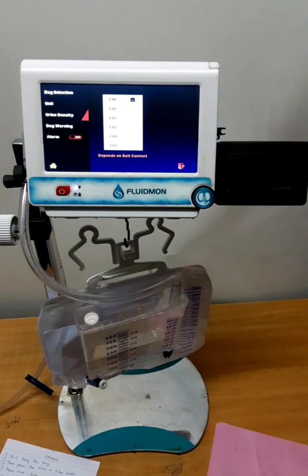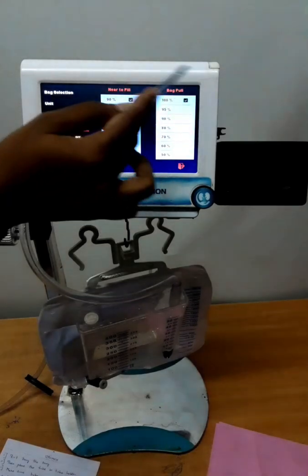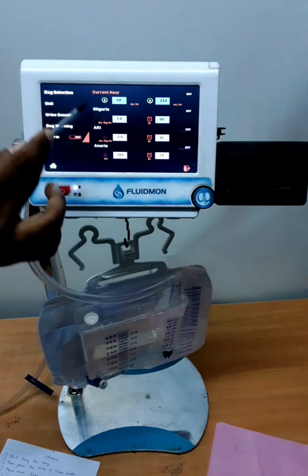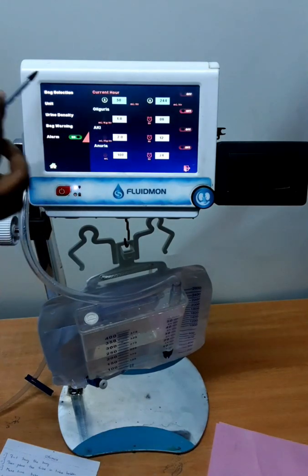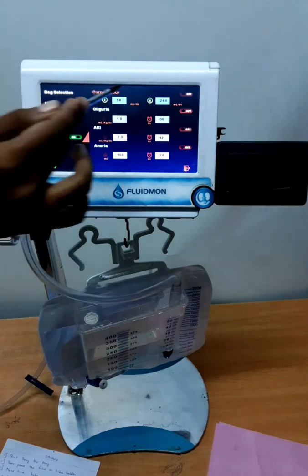Next is urine density. Urine density depends on the salt content. This is the bag warning alarm: there is a near-to-fill alarm and a bag-full alarm. This is the illness alarm — we have an oliguria alarm, AKI alarm, and anuria alarm. Turn on this alarm. You can also see high and low urine flow alarms.